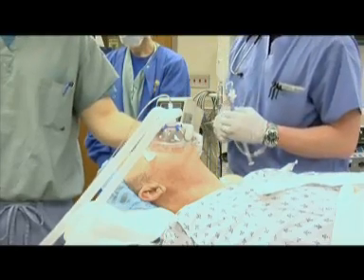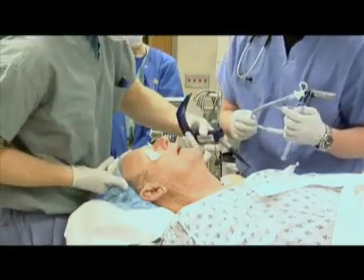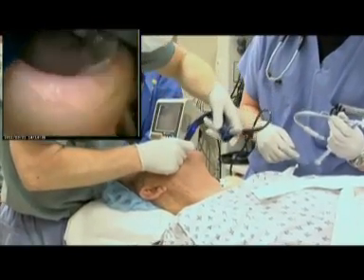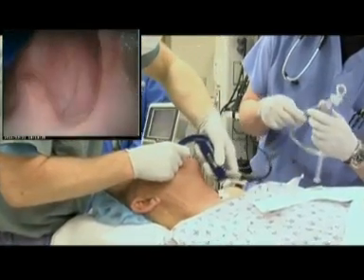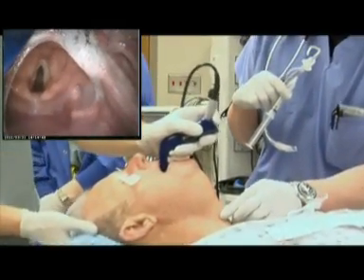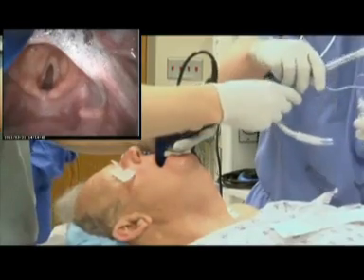After an appropriate period to allow for adequate muscle relaxation, we commence with the intubation sequence. Advancement of the Glidescope video laryngoscope is achieved via a midline approach. No lateral tongue displacement is necessary. Careful attention to oropharyngeal anatomy is maintained while inserting the blade to the base of the tongue. Attention is then turned to the monitor, which guides blade placement for optimal glottic view.